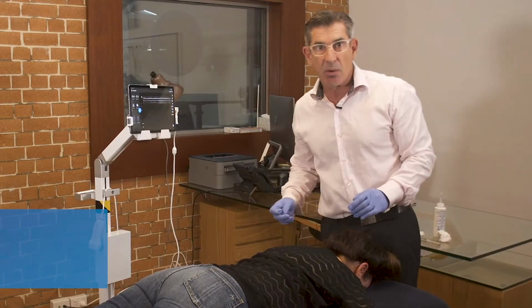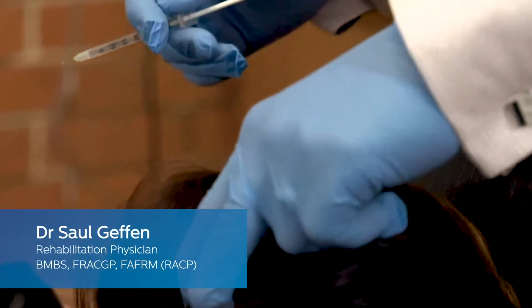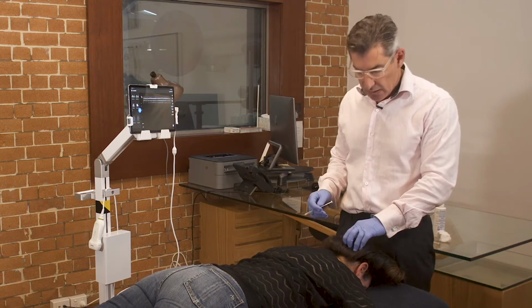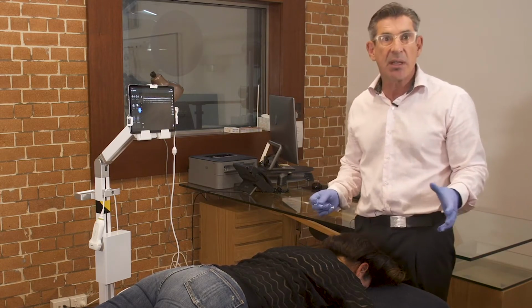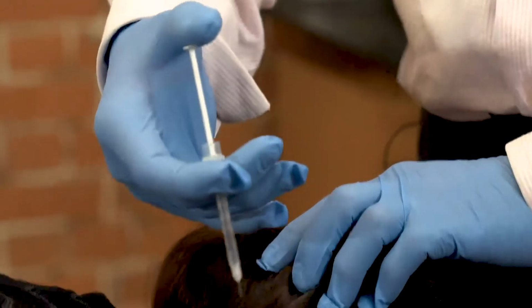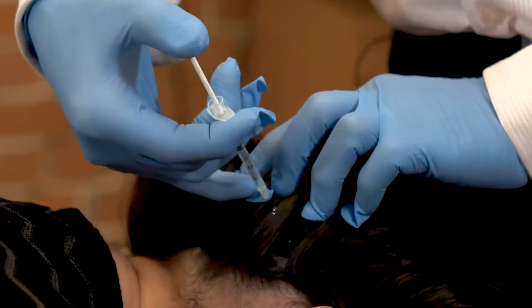Some injections don't require guidance, typically occipitalis and the suboccipital muscles immediately below the nuchal line. They don't require guidance to be injected. There's nothing else to hit there. And the protocol is to give 3 to 4 international units in multiple sites. And I'm just going to do that now. Scratch.